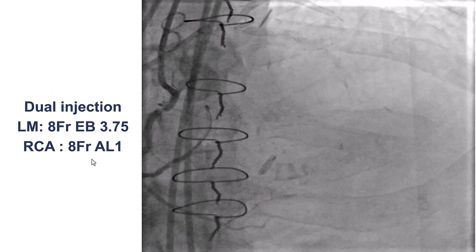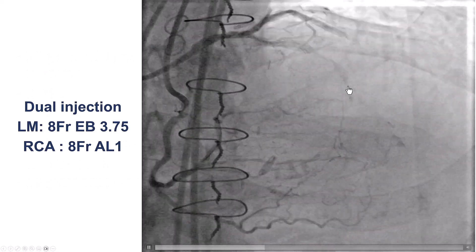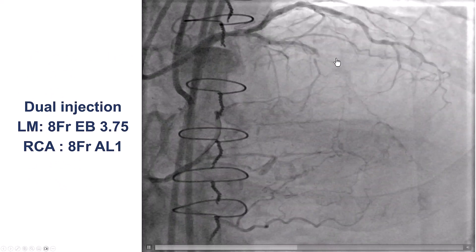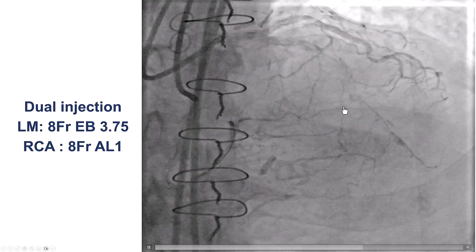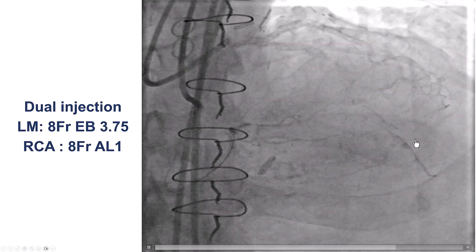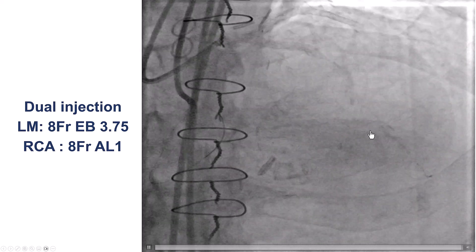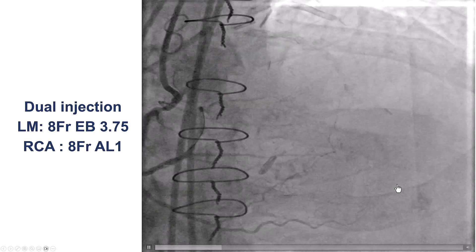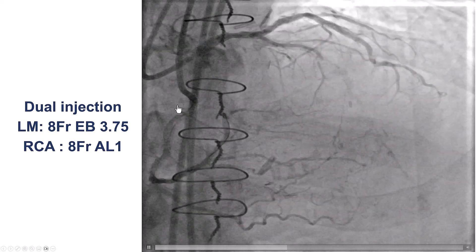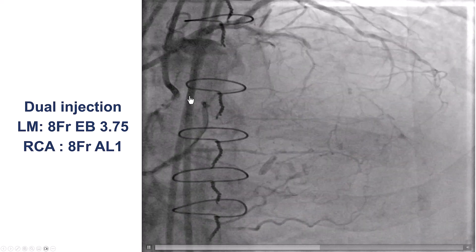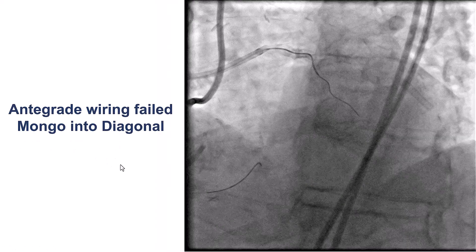This is the anatomy. The LAD is heavily calcified. The mid and distal LAD are filling through collaterals, mainly from the right coronary artery. This is a dual injection from the right and the left using eight French guides.